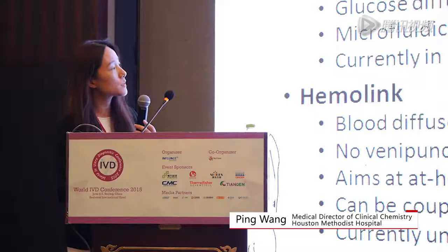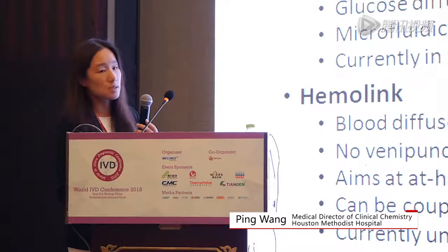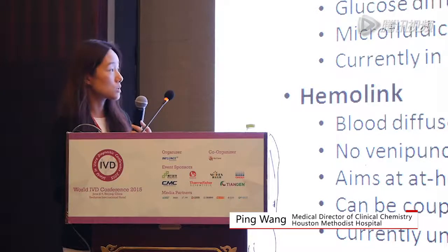However, here is a very novel device. It has a membrane on the surface of which it has special dye molecules called spiropyrans. These molecules will change their conformation under different lights, either UV lights or visible lights. When the conformation of the molecules is changed, the permeability of the membrane is changed at the same time. So if you put a device on your skin, for example, on your arm, then the blood glucose from under your skin in the capillary blood will permeate through this membrane, very cool technology, into the device itself and then get measured in the device. This is a very interesting device because you no longer even need a drop of blood. Currently, it's being tested in clinical trials.